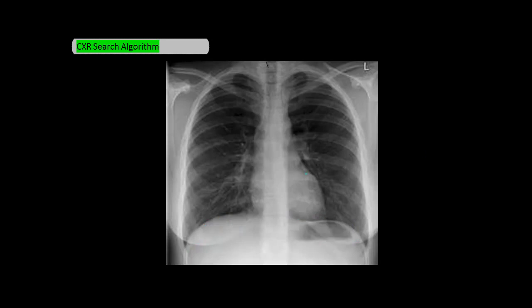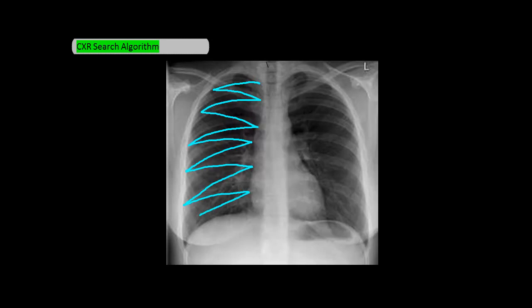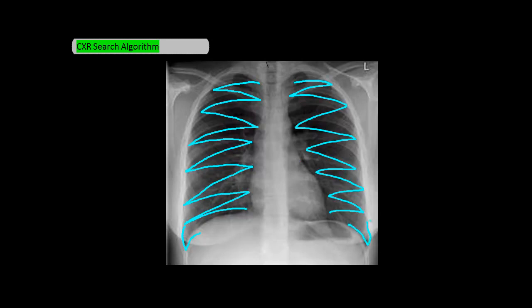And lastly, E for everything else. You want to scan the lung fields in a specific pattern to make sure you cover everything — I'm showing you the pattern I use to make sure I don't miss anything, and then repeating it for the other side. After that, check that the costophrenic angles are sharp, looking for any signs of blunting. Finally, check for any lines, such as ET tubes, NG tubes running from the esophagus to the stomach, feeding tubes extending into the duodenum, PICC lines going up into the SVC, or central lines such as an IJ central line.